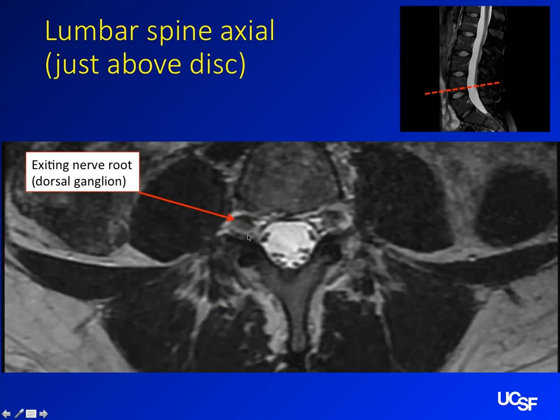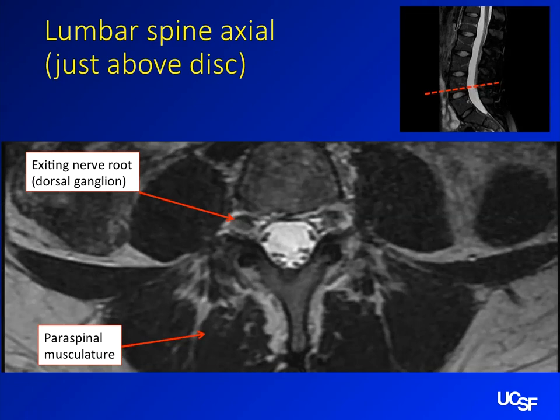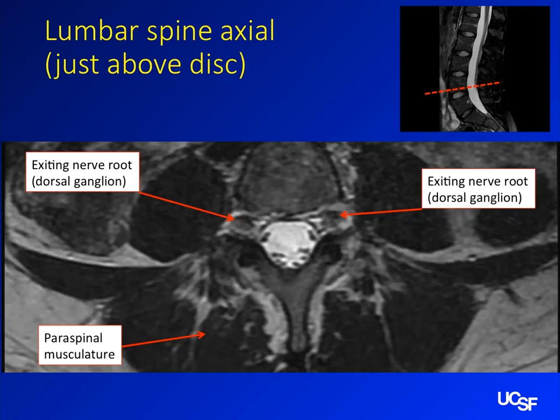Here we have paraspinal musculature — they have names but they're honestly not very important and you can look them up if necessary. Here's the exiting nerve root on the other side. It's worth noting that the nerve root comes out above the disc, so a lot of times you can have a really bad disc and that nerve root at that level can still be relatively safe.